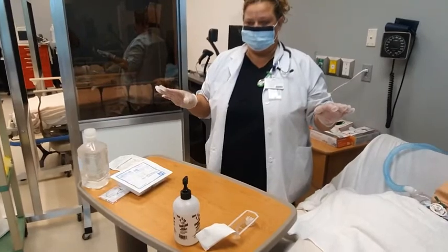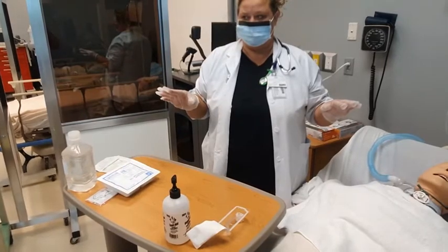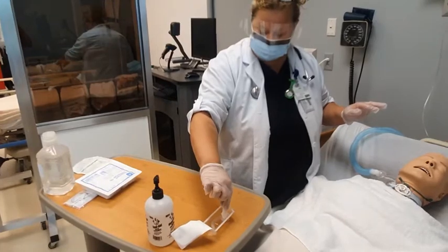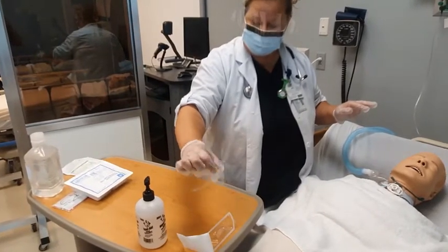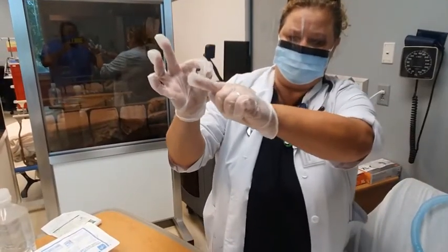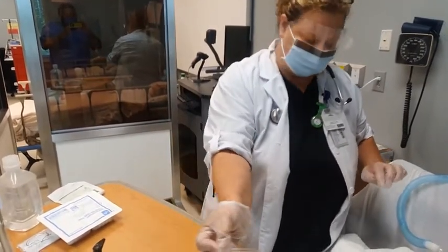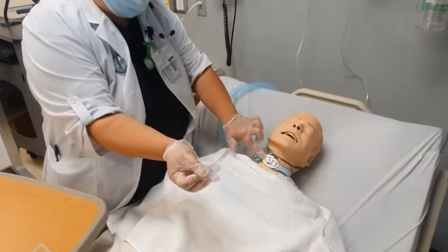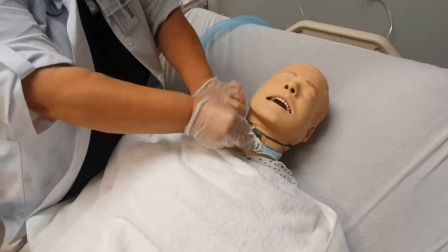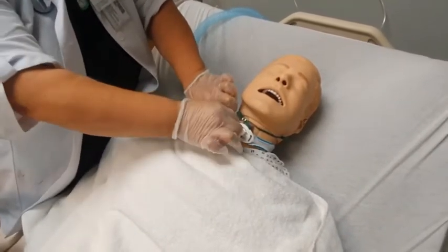Now you're going to insert your new inner cannula into the outer cannula, making sure that the inner cannula is secured. So you will take your cannula, only touching the top part here, as you have seen. You do not want to touch this part here at all with your hands, okay? So you can turn it with your fingers, insert it just like this. You'll hold this still, and you will insert here. And then the little flanges on the side, you'll pinch them to secure it to the patient's trach.